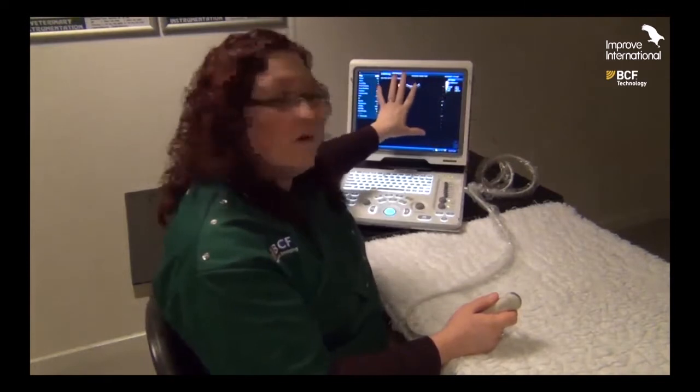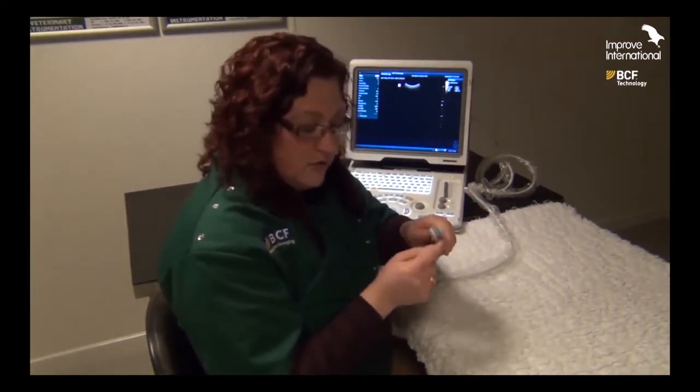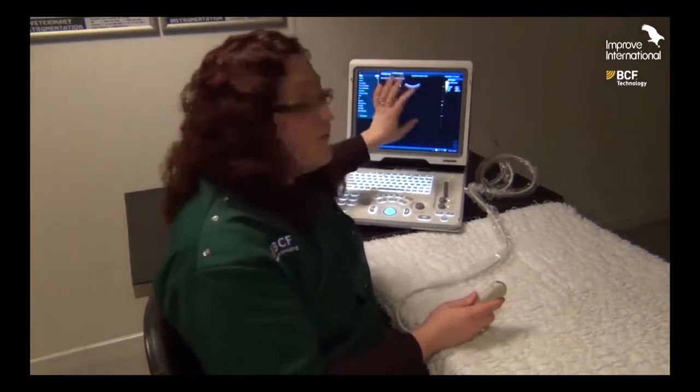Now we need to acquire the images, and part of this is the probe. The probe is what sends out the ultrasound wave but also receives it, sending the information via cable up to the console, which interprets it and forms the ultrasound image. The probe is quite an important part of the whole package. There are a few features of the probe we need to be aware of. The first is the footprint — the scanning surface which will be in contact with the animal. To ensure we can see the whole region we want to display, we need to ensure this portion of the probe is in good contact with the patient at all times.